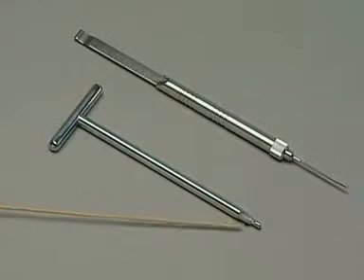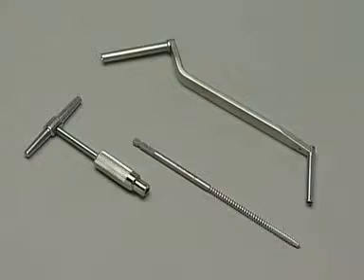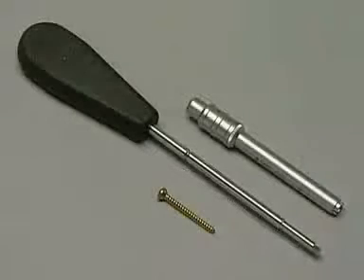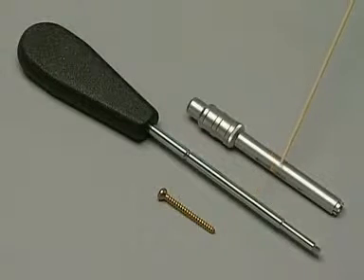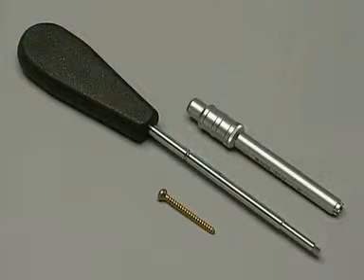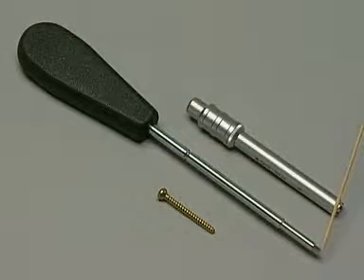The 4.5 mm countersink. The large depth gauge. The 4.5 mm tap with T-handle. Again with the double drill sleeve, 4.5/3.2. The hexagonal screwdriver with corresponding holding sleeve. And 4.5 mm titanium cortex screws.